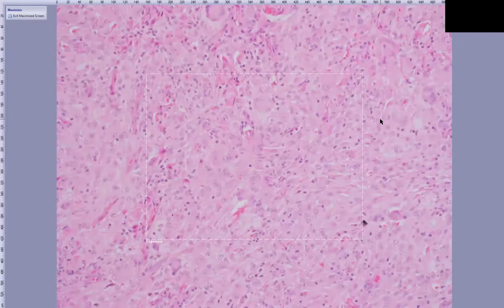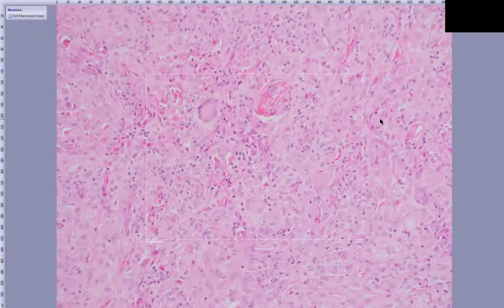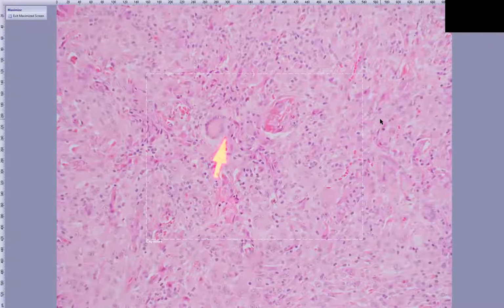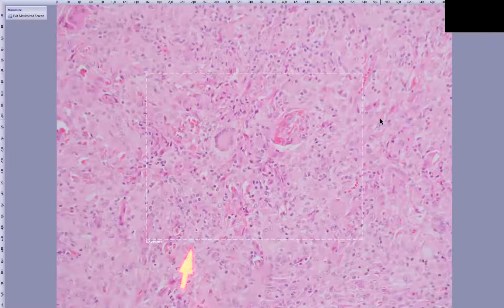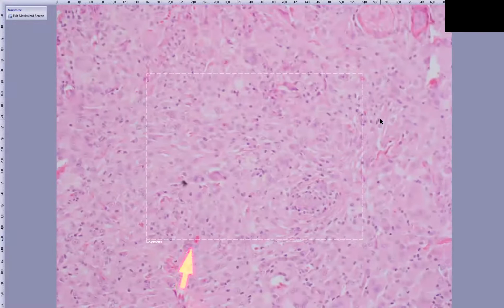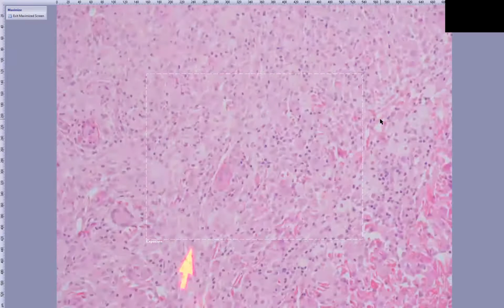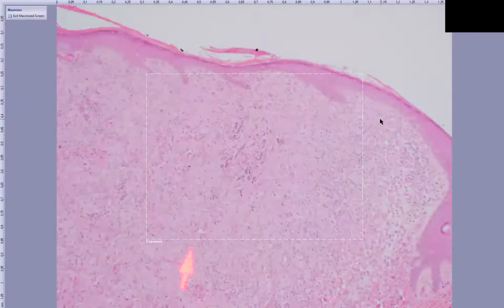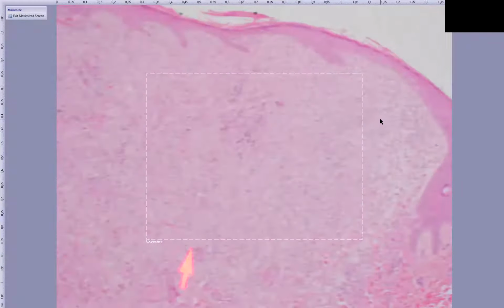So in summary, in juvenile xanthogranuloma, look for a diffuse but well-circumscribed infiltrate of epithelioid histiocytes with admixed Touton giant cells characterized by your wreath-like arrangement of nuclei with foamy cytoplasm at the perimeter, and a very minimal admixed inflammatory cell infiltrate, mostly lymphocytes, plasma cells, maybe some eosinophils. And then on low power, recognizing the dome-shaped architecture of these lesions and the epidermal collarette is also helpful.